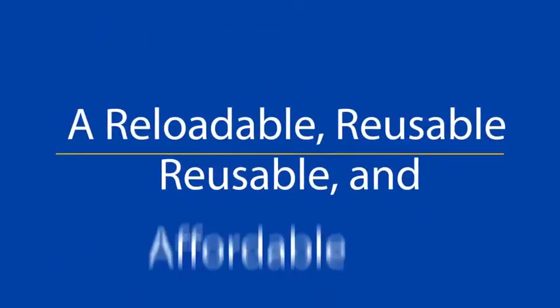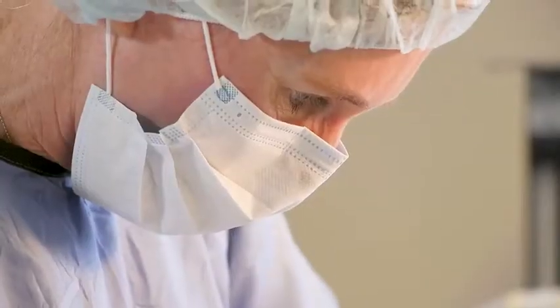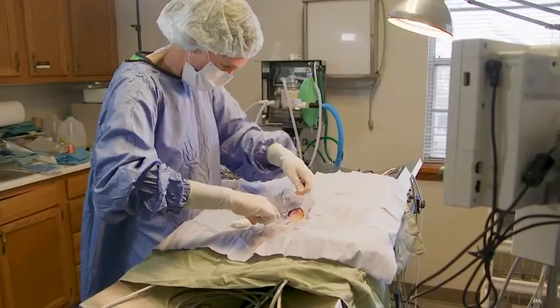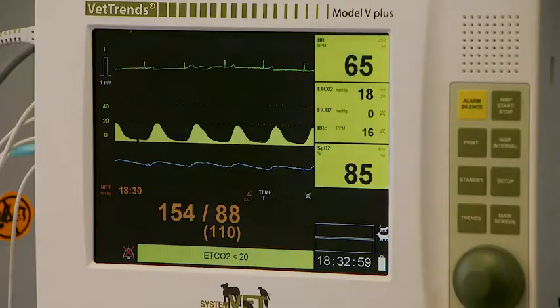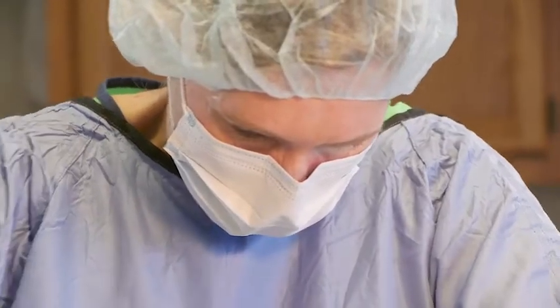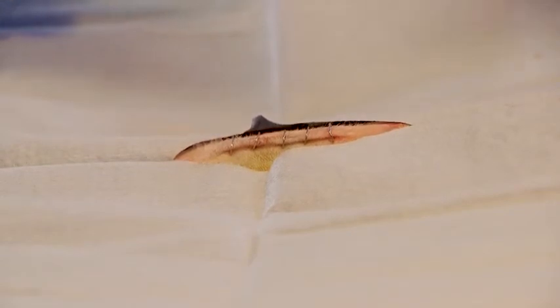Finally, a reloadable, reusable, and affordable surgical skin stapler for veterinarians. Using staples for skin closure are much faster than traditional suture placement, thereby reducing both surgical and post-op recovery time. Staple placement is a simple technique that provides excellent cosmetic results.